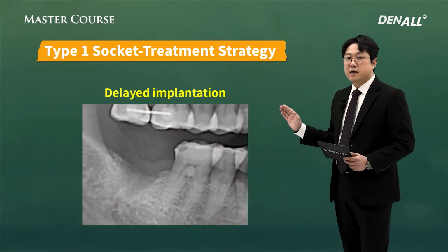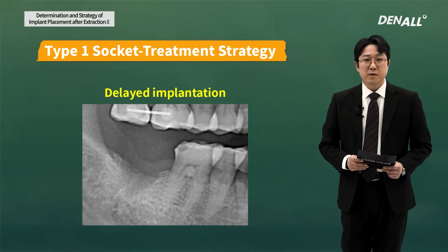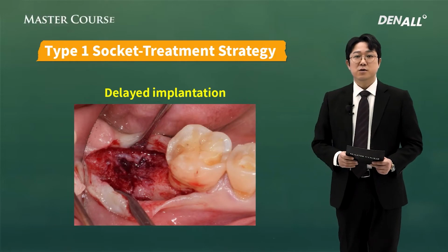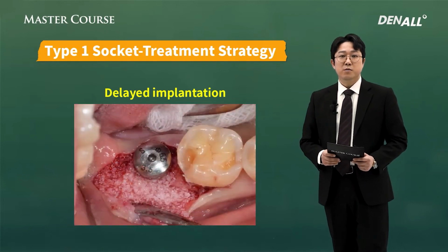On the X-ray image, the bone is not fully filled in the socket, but it's okay. If you open the flap, you can see a certain level of bone fill. And there's no major difficulty in placing the implant.